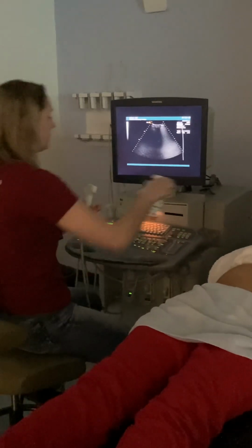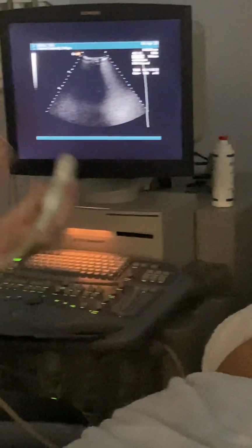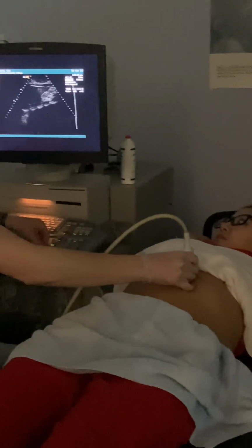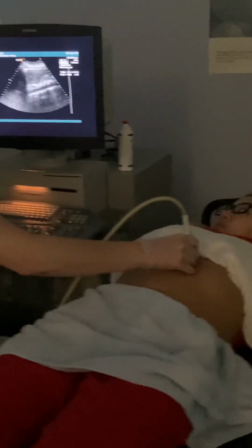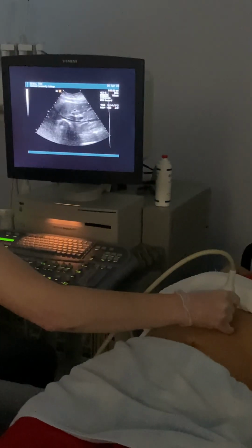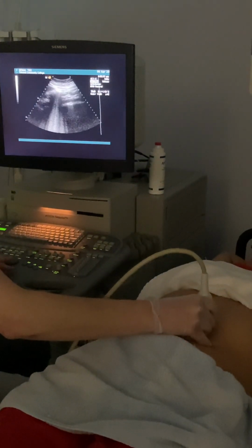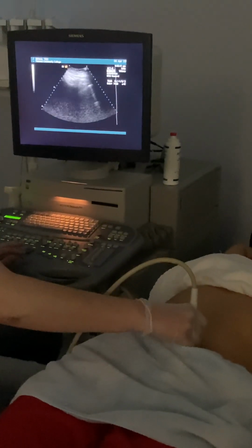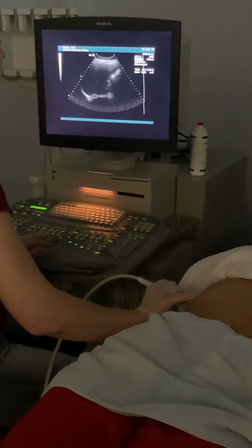Okay. So when we annotate this, well, let's start from the very beginning. So we're gonna do what we would do for a normal renal ultrasound. So, let's get our 2D out. So we would do our SAG IVC, looking for any tumor invasion. We would do our prox aorta, mid aorta, distal aorta. We're going to do our urinary bladder, with and without jets. And then we would do our native kidneys. So we would just take a sagittal image, look for pathology, do our sagittal image right, sagittal image left.